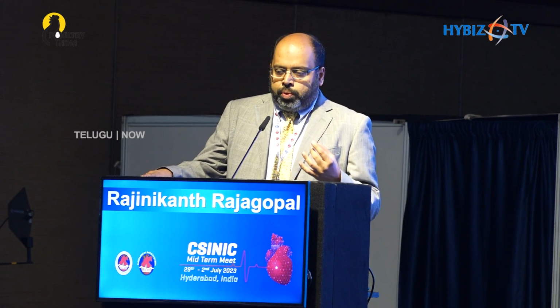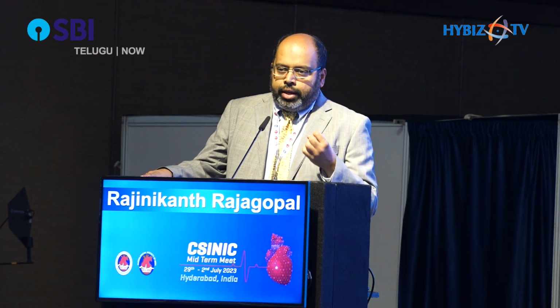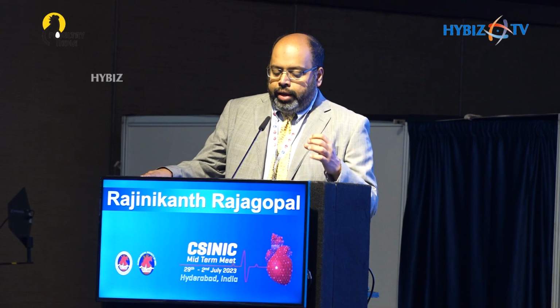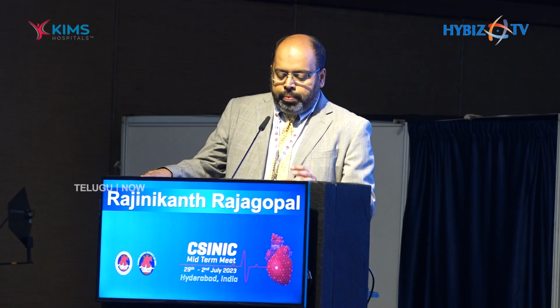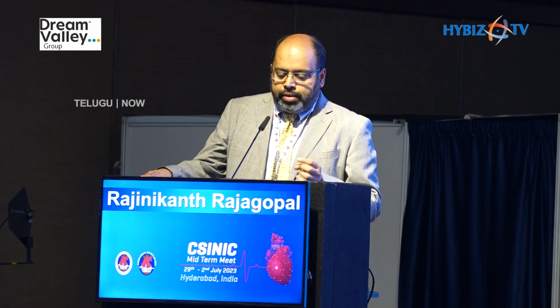So first we look at mechanical factors. The most common by far is underexpansion. So during the initial index procedure, if the stent was not fully expanded, it leads to ISR in the future. And that could be either because of low deployment pressure when you deliver the stent or post-dilate, or because of calcium behind the stent struts, which has not been adequately prepared. The other causes could be undersizing, a smaller stent in a big vessel, stent recoil, stent fracture, and geographical miss. And there are some illustrative pictures on the right where you can see the vessel is quite big and the stent is way away from the EEL, and therefore it's clearly underexpanded.